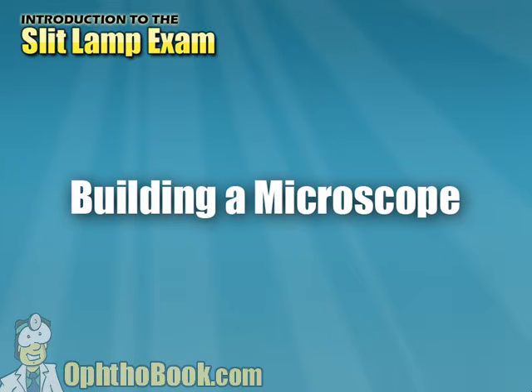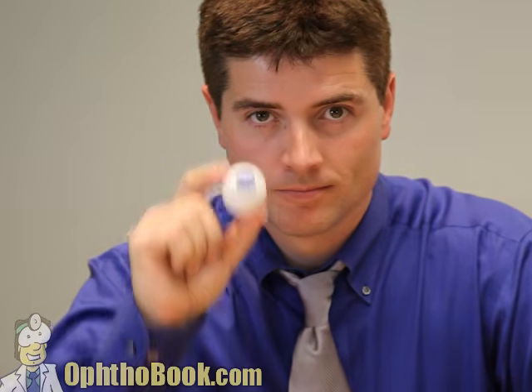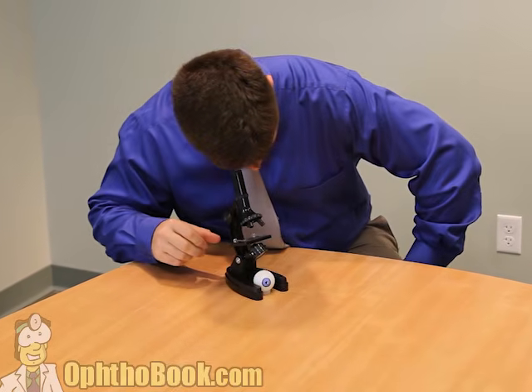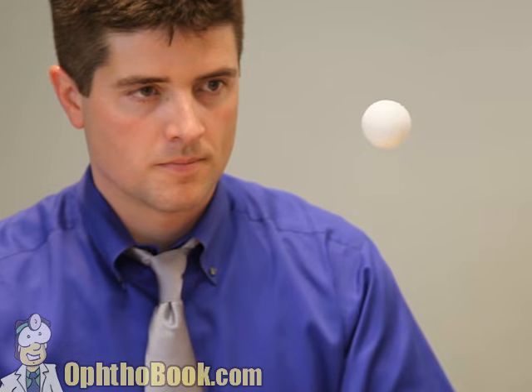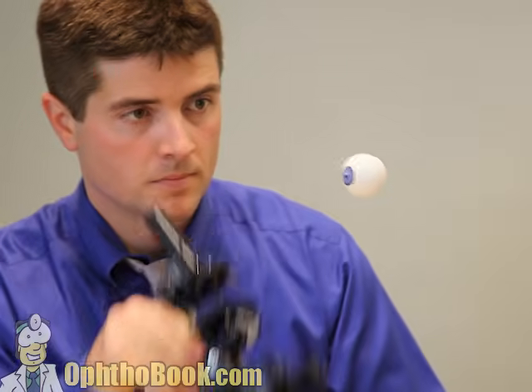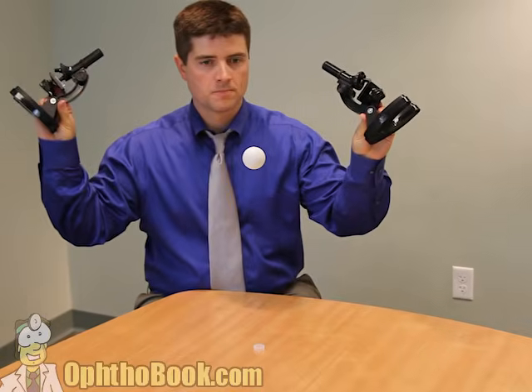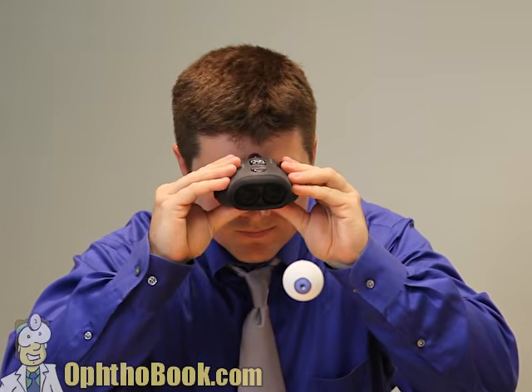Now, the eye, as we know, is a very small structure. It's about 1 inch in diameter, and in fact, the part of the eye that we look at, the anterior segment, is even smaller than that. So we really need a microscope to see what we're doing. We don't need a high-powered microscope. We're not looking at individual cells, but we certainly need one. But our patients don't like to lay flat. They like to sit up. And so we need to take a microscope and move it so it's in a horizontal axis so that we can look at the eye. Let's improve our design by creating a binocular microscope, 2 of them, but let's meld these together into a single unit so that they're in focus and synchrony with each other, and this is basically the perfect microscope.